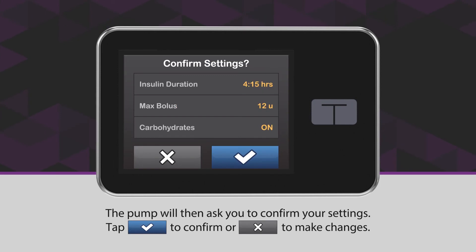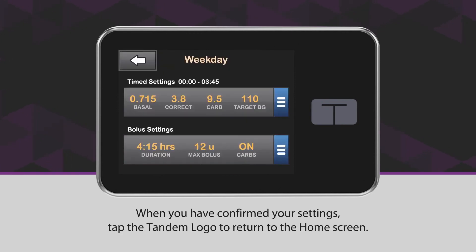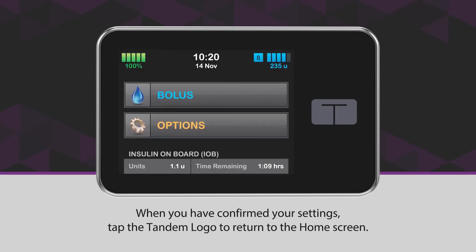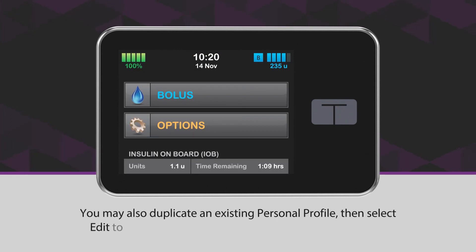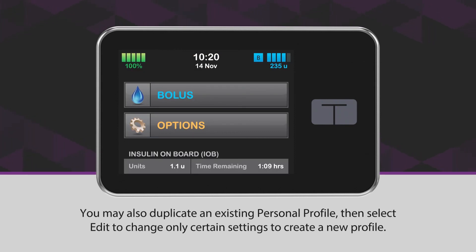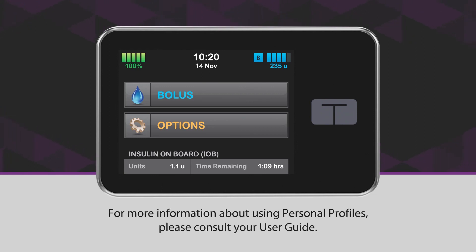The pump will then ask you to confirm your settings. Tap the blue checkmark icon to confirm, or the X icon to make changes. When you have confirmed your settings, tap the Tandem logo to return to the home screen. If you need to add additional personal profiles, repeat the steps outlined in this video. You may also duplicate an existing personal profile, then select Edit to change only certain settings to create a new profile. For more information about using personal profiles, please consult your user guide.